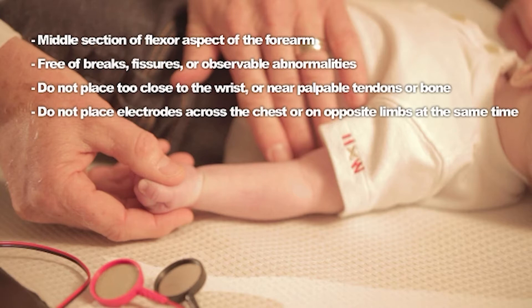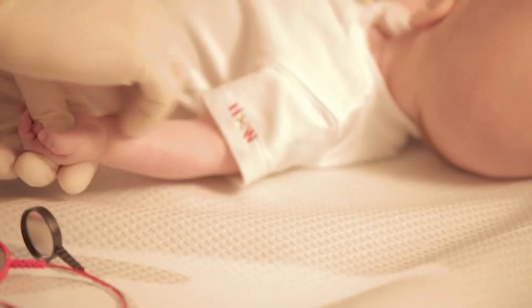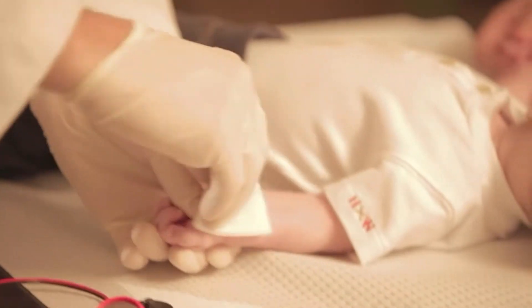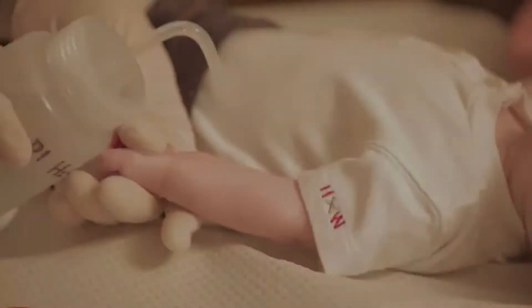Do not place electrodes across the chest or on opposite limbs at the same time. Clean the skin at selected sites to remove dirt, oil, and loose dead cells to minimize the electrode's impedance of the skin. To do this, put on gloves and swab the area vigorously with alcohol, then clean the area with deionized water and wipe dry.